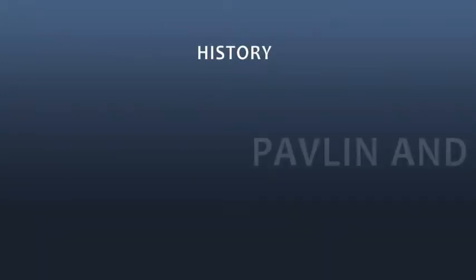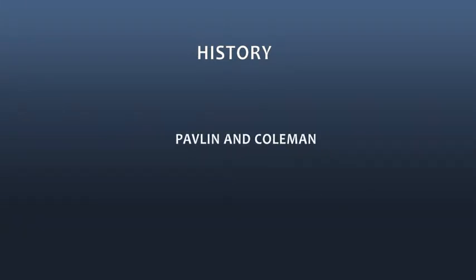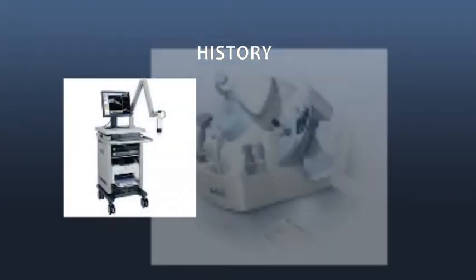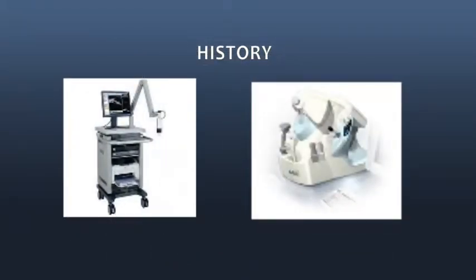The history of this type of ultrasound dates back to Chuck Pavlin and Jack Coleman, both of whom developed laboratory instruments and then commercial units for performing anterior segment high-resolution ultrasound. But many things have changed and made it simpler and easier to use, and that's the reason for this presentation.